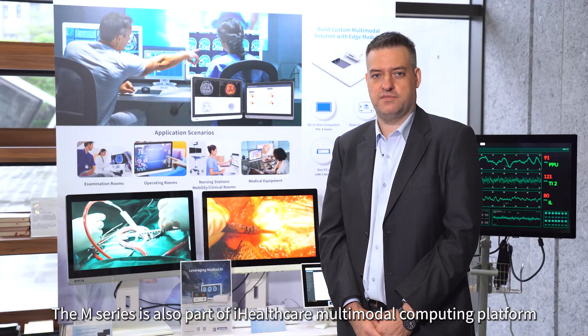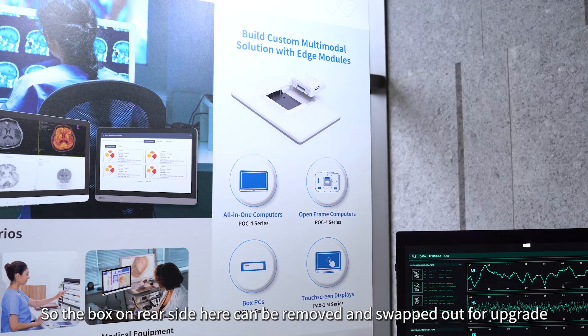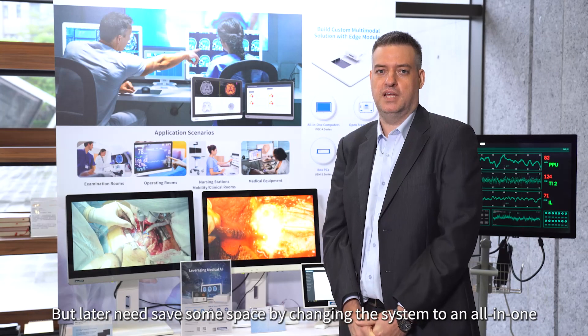The M series is also part of the iHealthcare multimodal computing platform. The box on the rear side here can be removed and swapped out for upgrade. For example, maybe you bought the monitor to connect with an old box PC but later need to save some space.